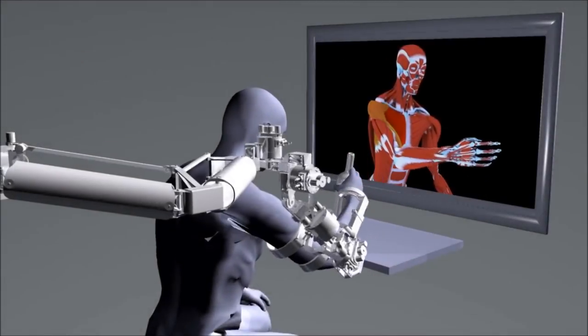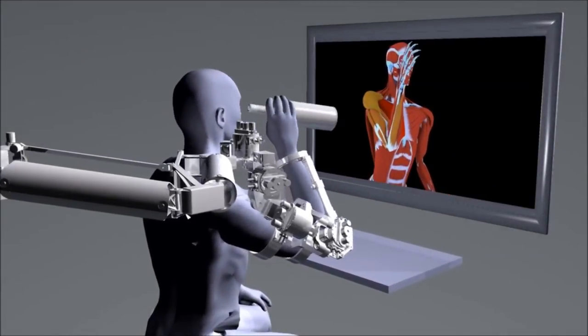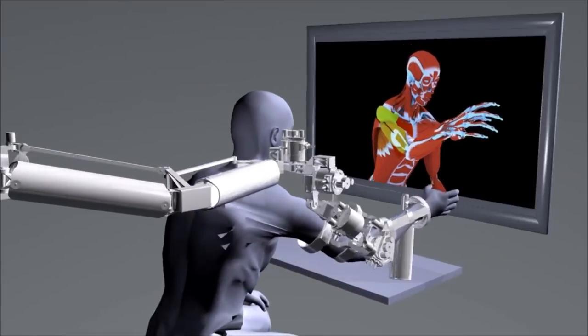This animation shows what could be possible when the LIMPACT, visual feedback and virtual reality are combined.